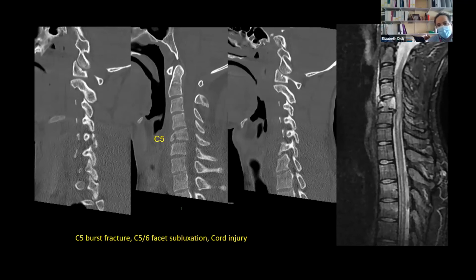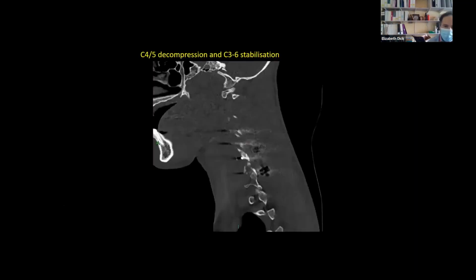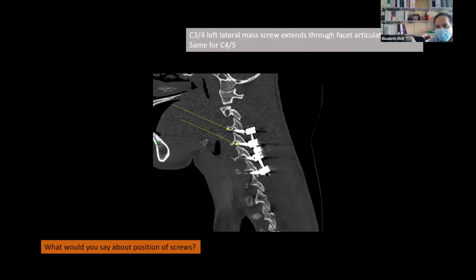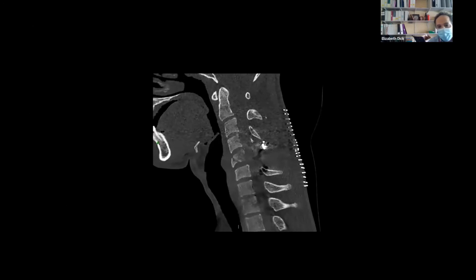So what they decided to do, and you can do either an approach from the front combined with the back, or just the back alone. The surgeon in this instance decided to tackle it from behind and do a midline posterior cervical decompression and stabilization. If you look through the midline, you will see the skin clips from the operation, and you can also see the spinous process and the laminae, which is the level of the injury, where the decompression has been done.